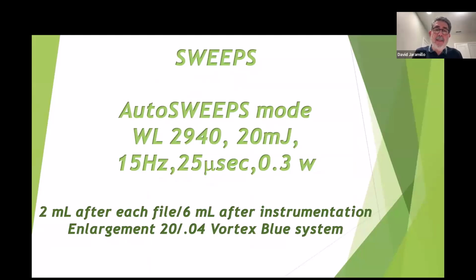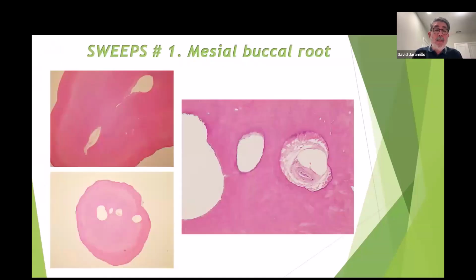So it's a mess. But anyhow, SWEEPS is, like Dr. DeVito says, PIPS with steroids. It's more aggressive because every 25 microseconds compared to 50 microseconds impulse. So because it has double the impulse per microsecond, that's why we see more cavitation, more streaming being produced.